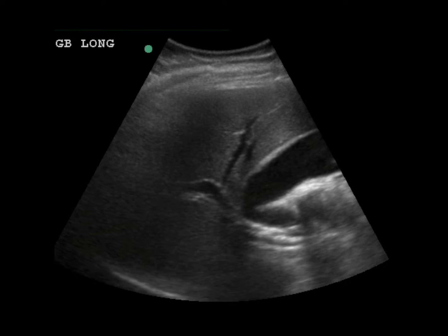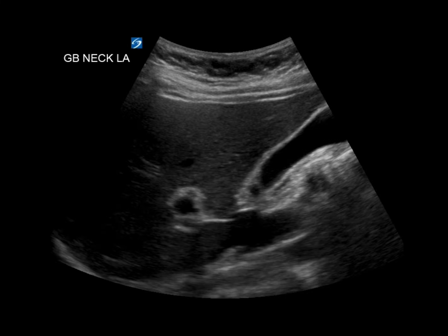Now, in this example, our gallbladder neck is actually tucked back under. The gallbladder neck comes right like that and up this way. So this area right here is our gallbladder neck, and we really want to make sure if we see any stones in that area, because if a stone's impacted there, that's going to eventually lead to cholecystitis. We're going to look at another example.